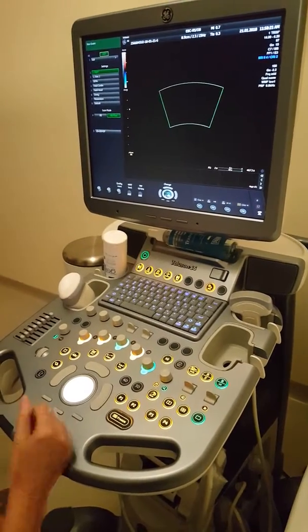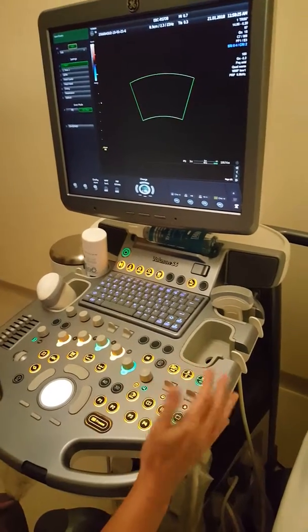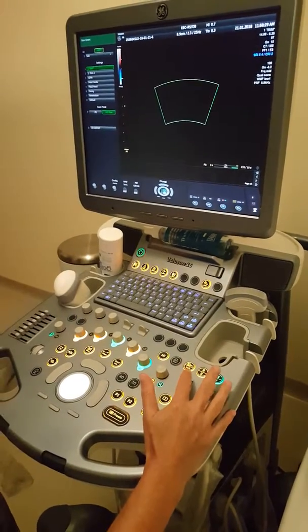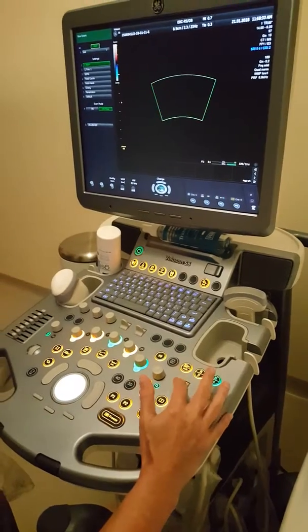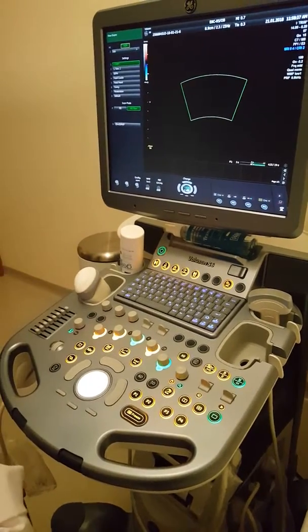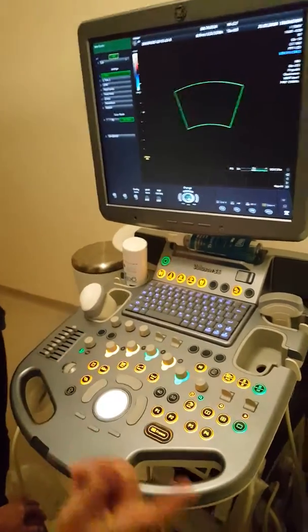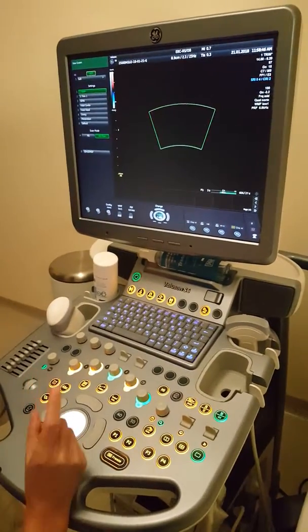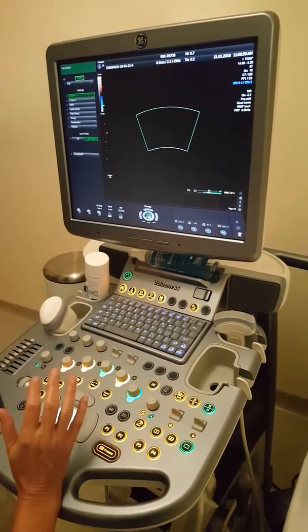And sometimes, that was for the gynae bit that I wanted a bit higher, and that is the depth, the one next door. Yes, exactly. I get it, that is what I mean. I don't know exactly, but I just know that I wanted a bit. And then the cervix, because that's the main thing, gynae-wise. The cervix of the pregnant woman. That was the gynae program again, and I think that it showed cervix then.